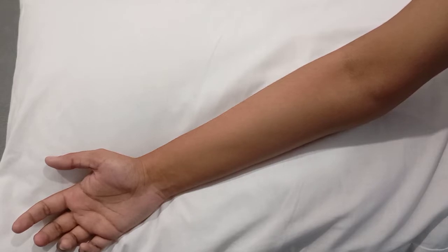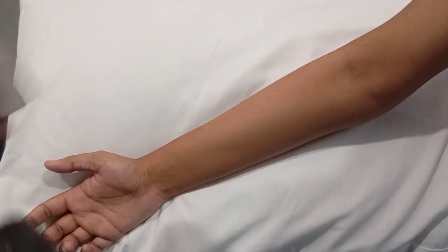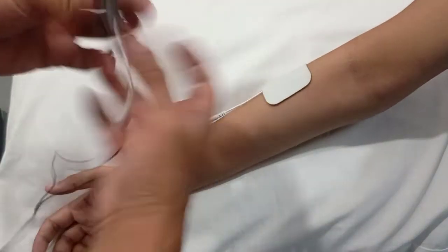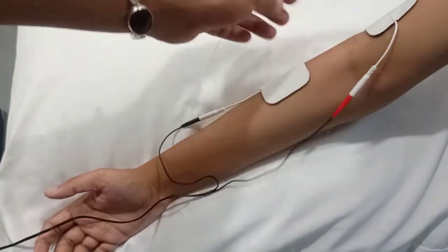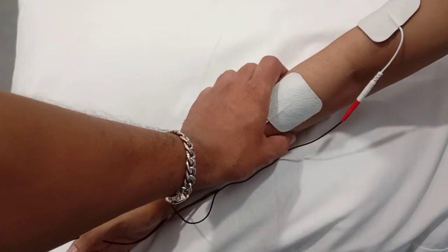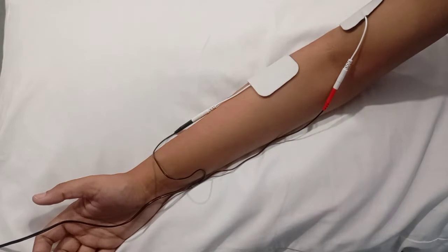For an acute condition, the electrode configuration is simple: we are going to apply the electrodes below the elbow and above the lateral epicondyle. This is the electrode position or arrangement, and now let's discuss the machine parameters.